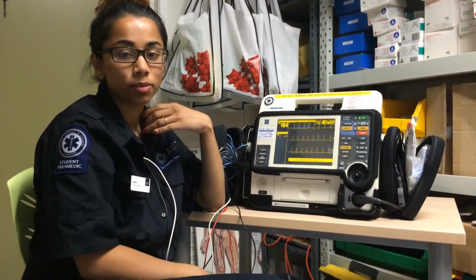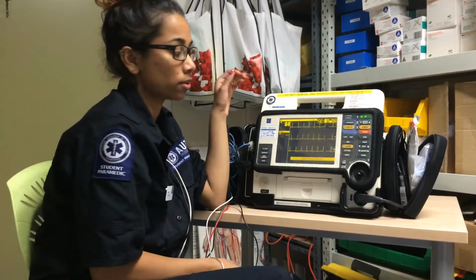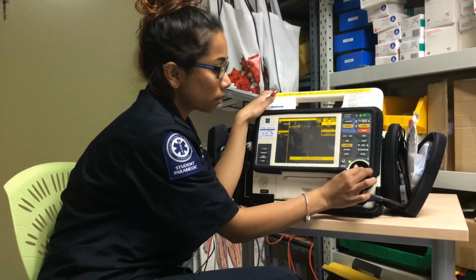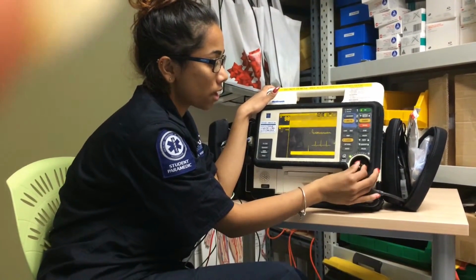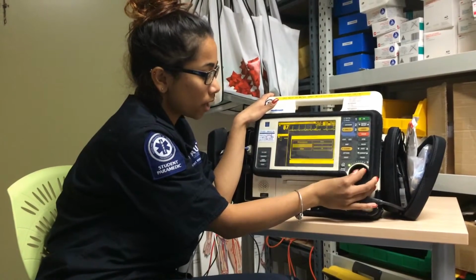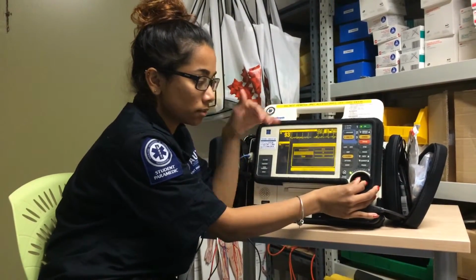You can choose between the leads by pressing the lead button. It gives you a number of options, and you can simply choose whichever one you want, and it will come up on the live feed. So you click lead, the one you desire, and you can also then select through the channels like so. And if you want a specific lead, you can then also change that and have a look at that as well.